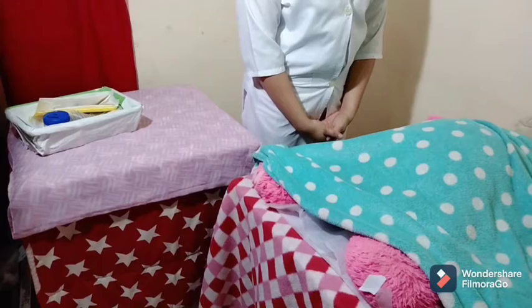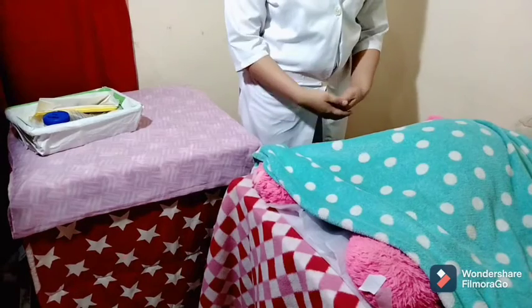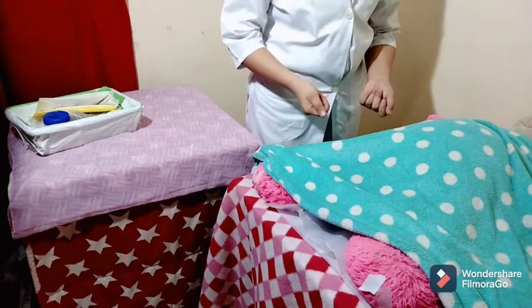Place the client in a dorsal recumbent position with the feet apart and drape the client. Good visualization of the meatus is important. Embarrassment, chilliness, and tension interfere with the introduction of the catheter. I'm going to position you in the recumbent position, and can you flex your knees?